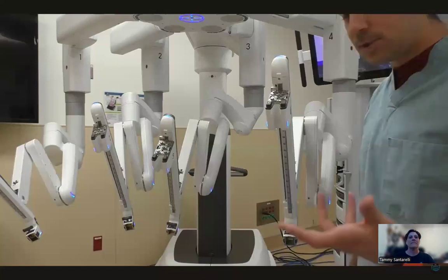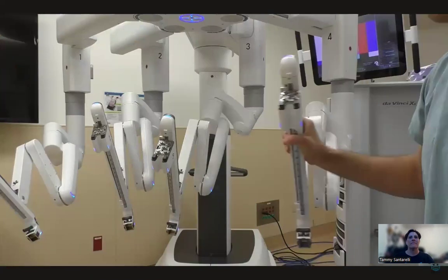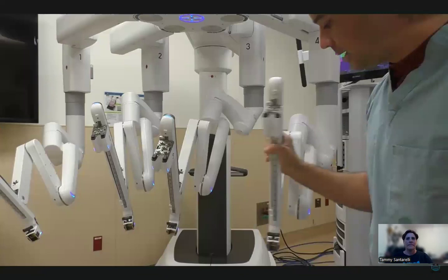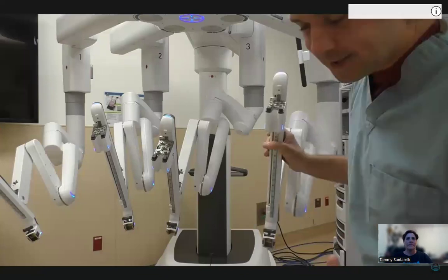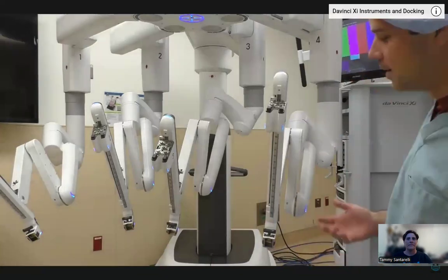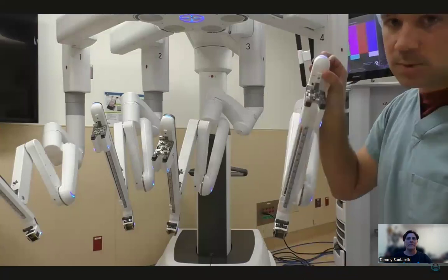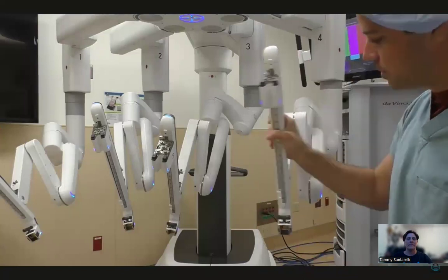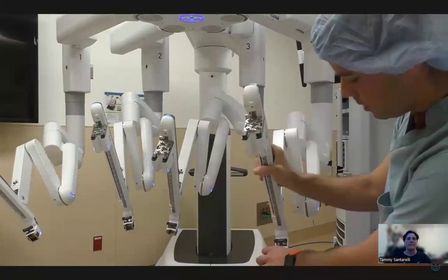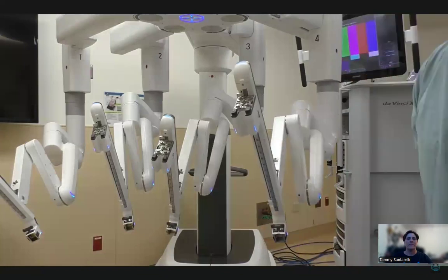Now, what's new with the Xi, which is pretty cool, is the fact that you can just grab it and you can move it yourself in all of these directions. I feel like that's a little bit too much brute force than I'm used to. So I do still use the buttons because it's fine movements and it's easier to dock these arms with fine movements rather than just taking the whole thing and trying to put it into the trocar this way. Much easier with fine movements with the buttons.